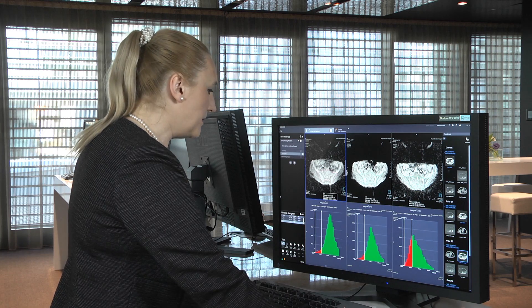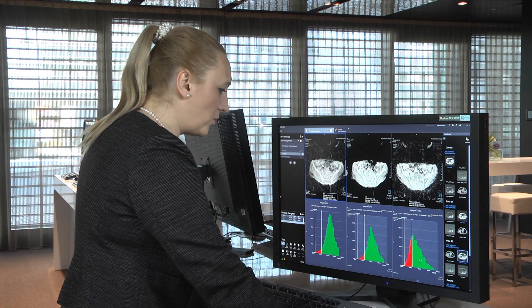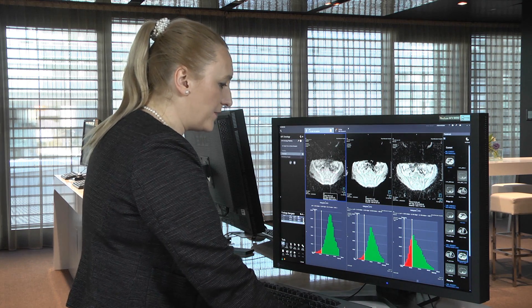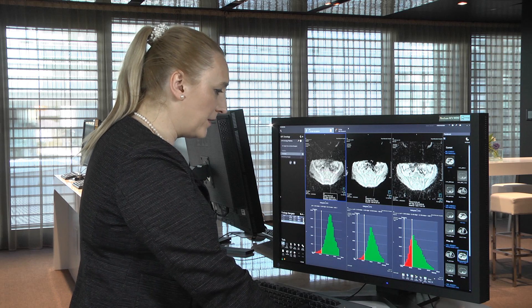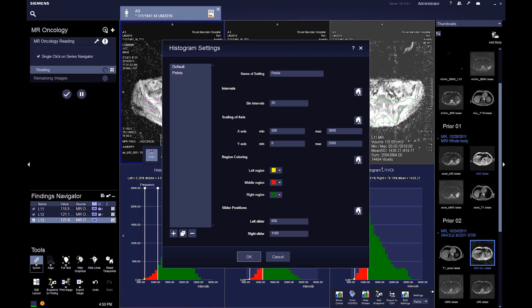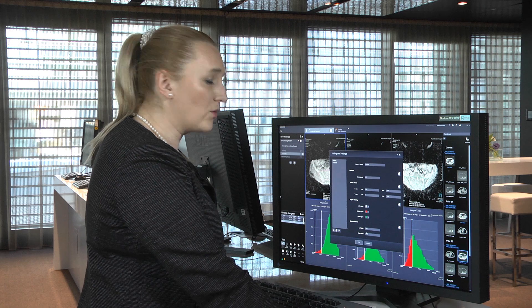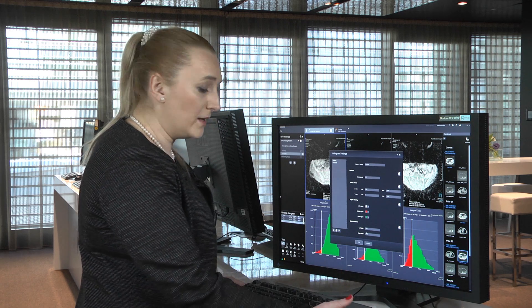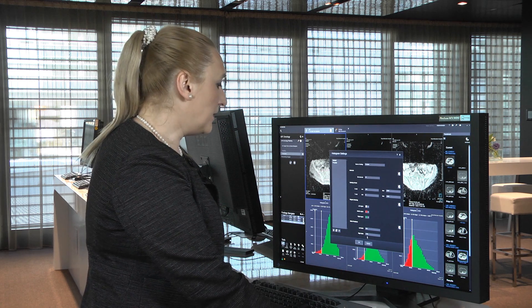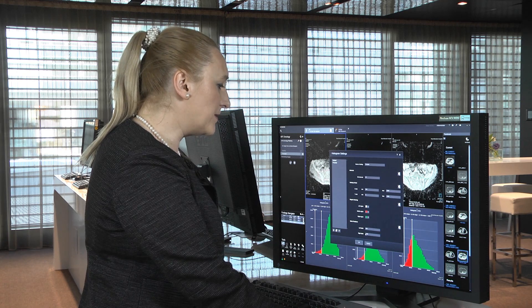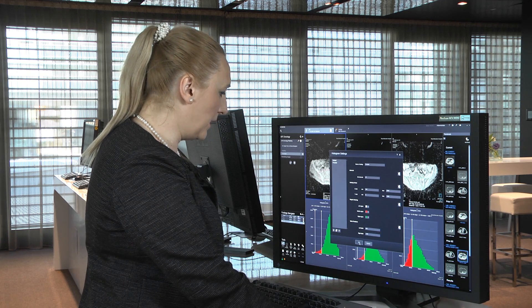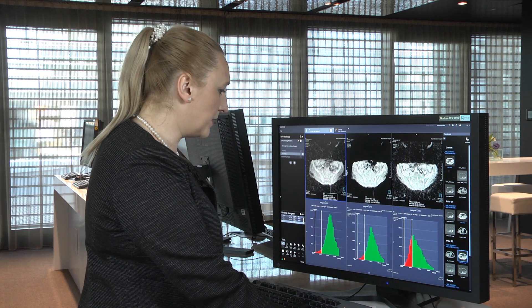These are the histograms, and the histograms have thresholds which we have set up arbitrarily based on our experience. Here we have set that the normal bone has an ADC less than 650, and we have decided that the cellular tumor is probably somewhere between 650 and 1100.